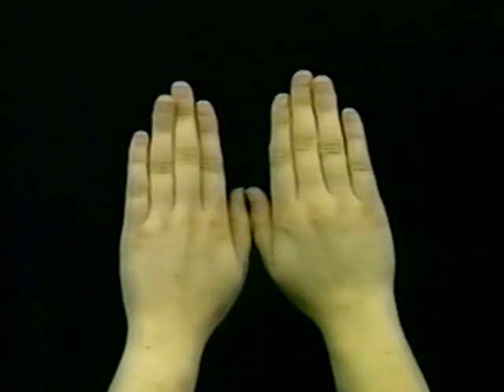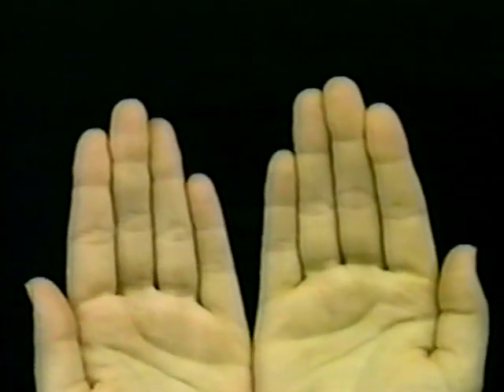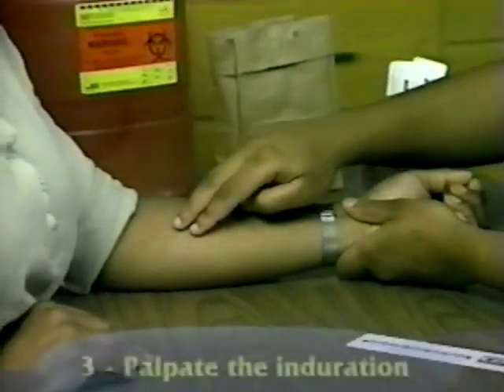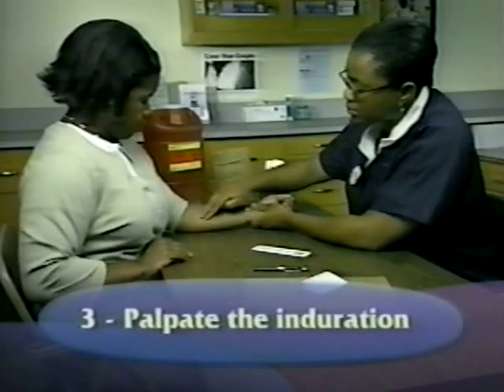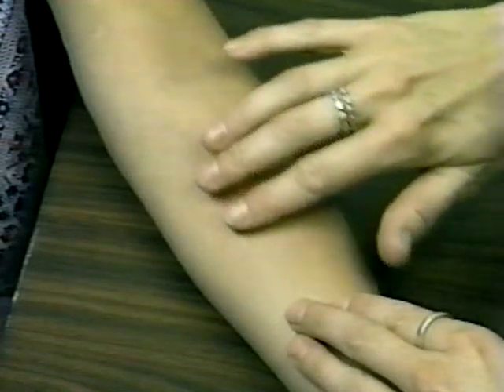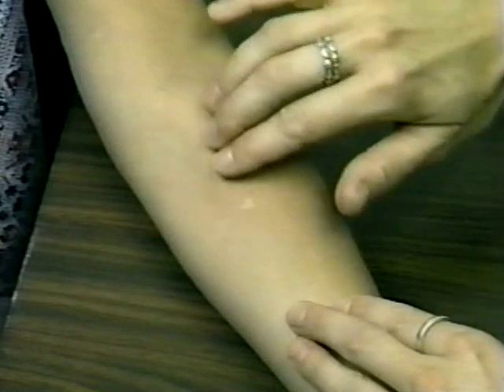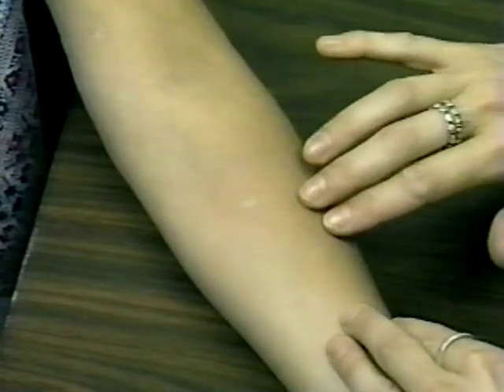In order to feel the induration properly, keep your fingernails short enough so that they don't protrude beyond the finger. The induration is not always visible, so you must rely on palpation with your fingertips. With your fingers together, touch the area lightly with the pads of your fingertips. Using a light, gentle motion, sweep the fingertips over the surface of the forearm in a two-inch diameter in all four directions to locate the margins or edges of induration.